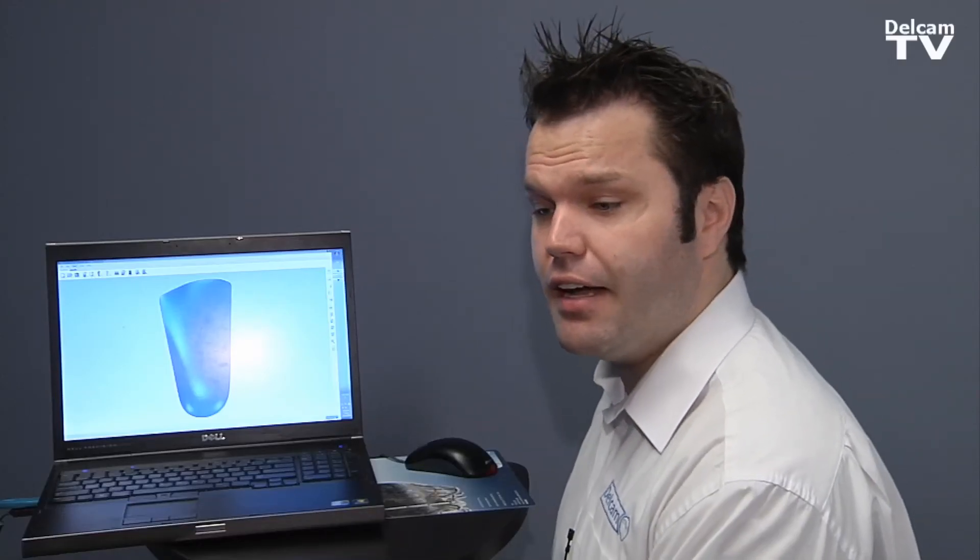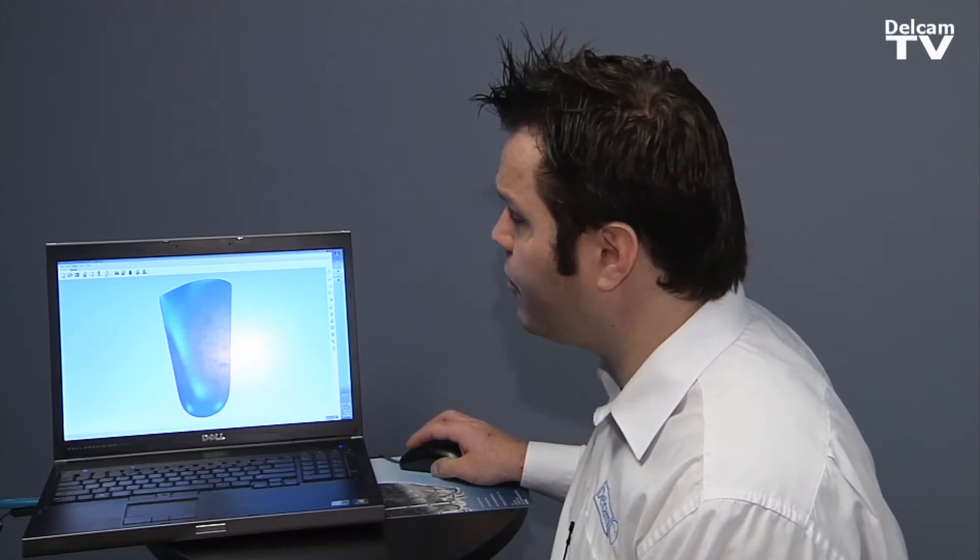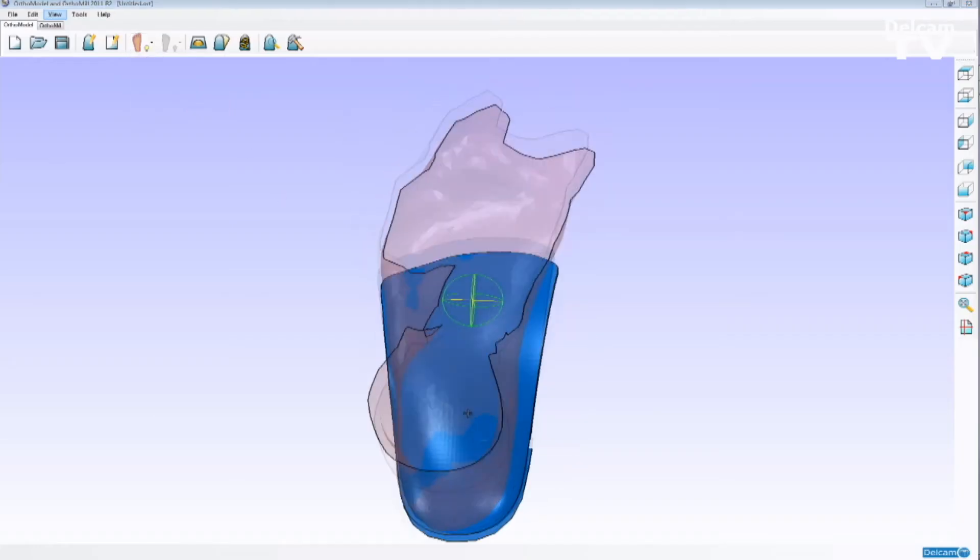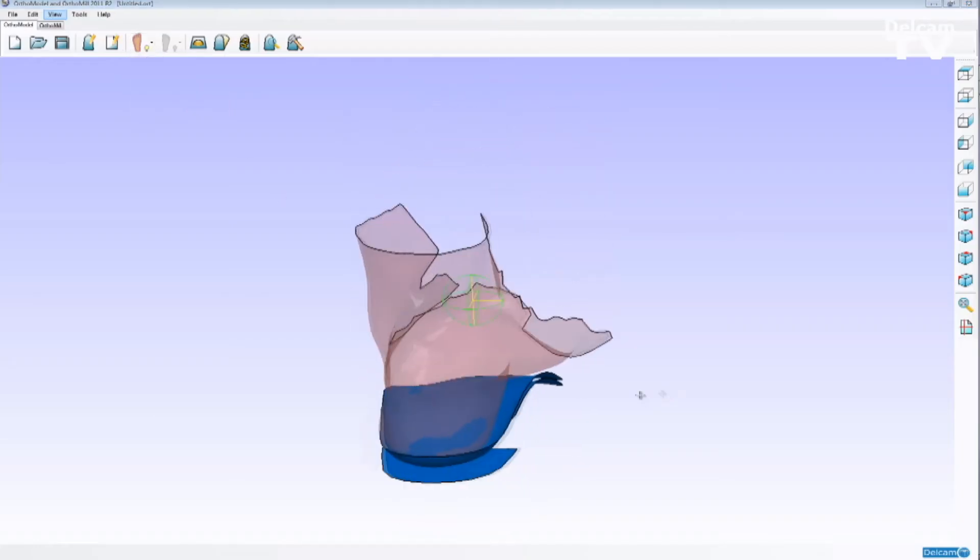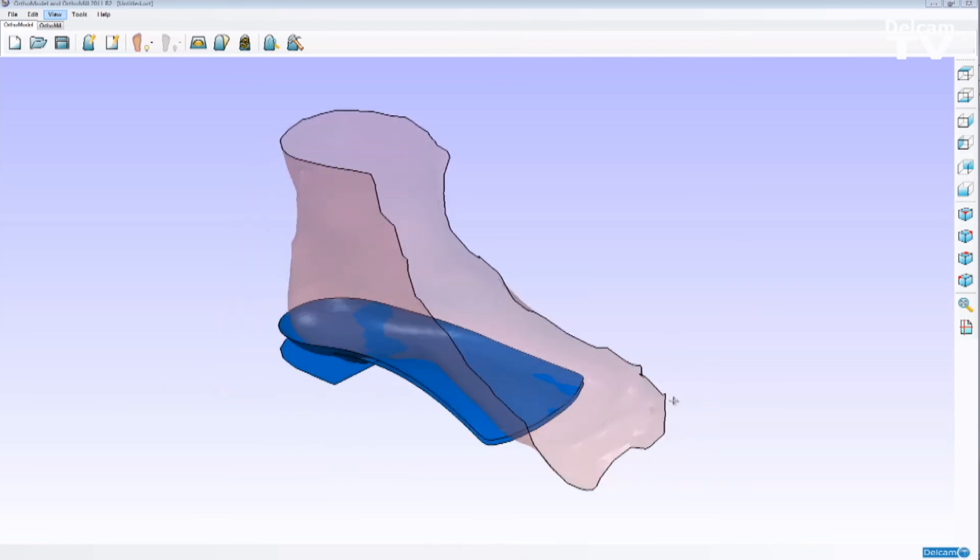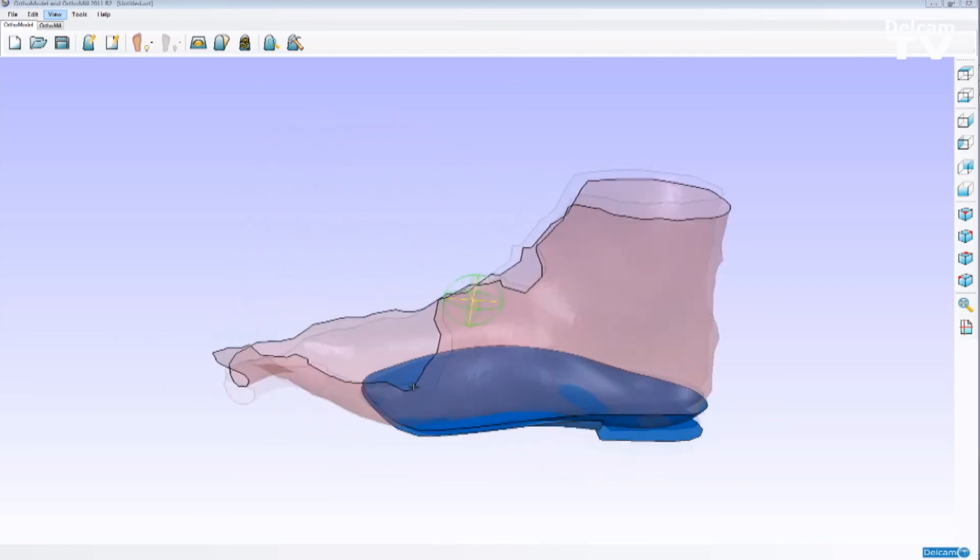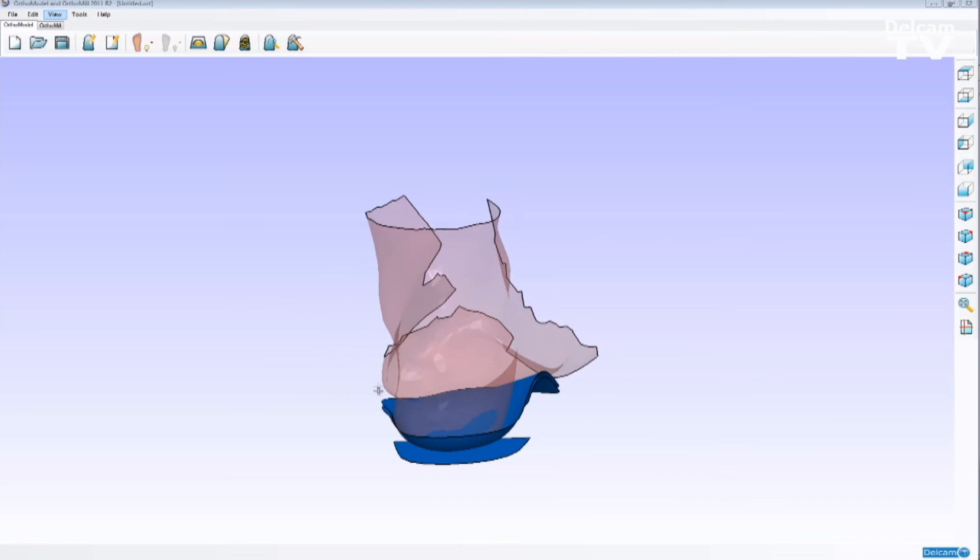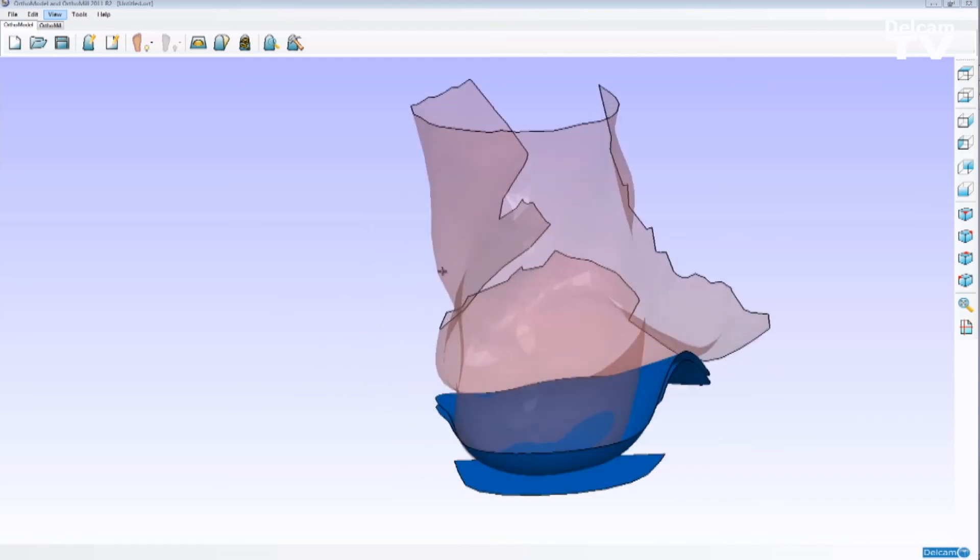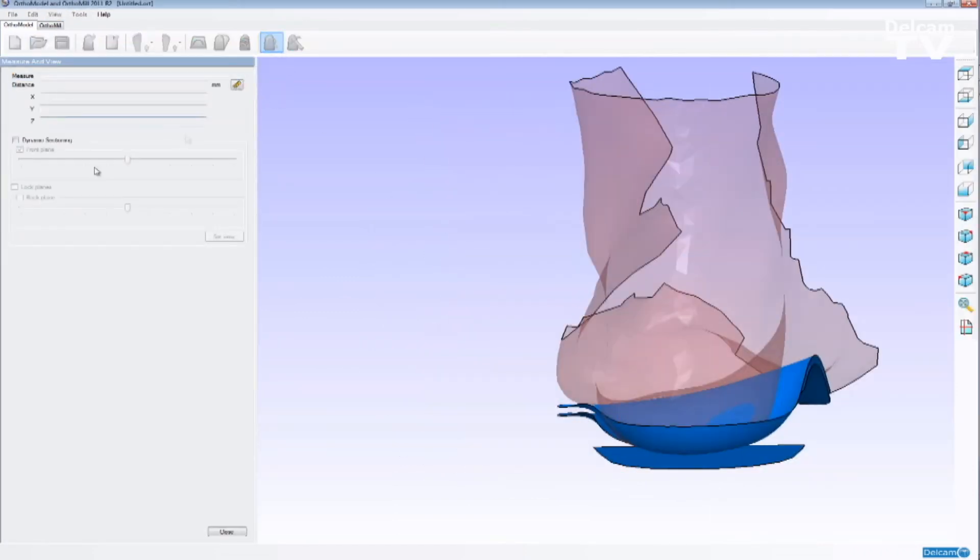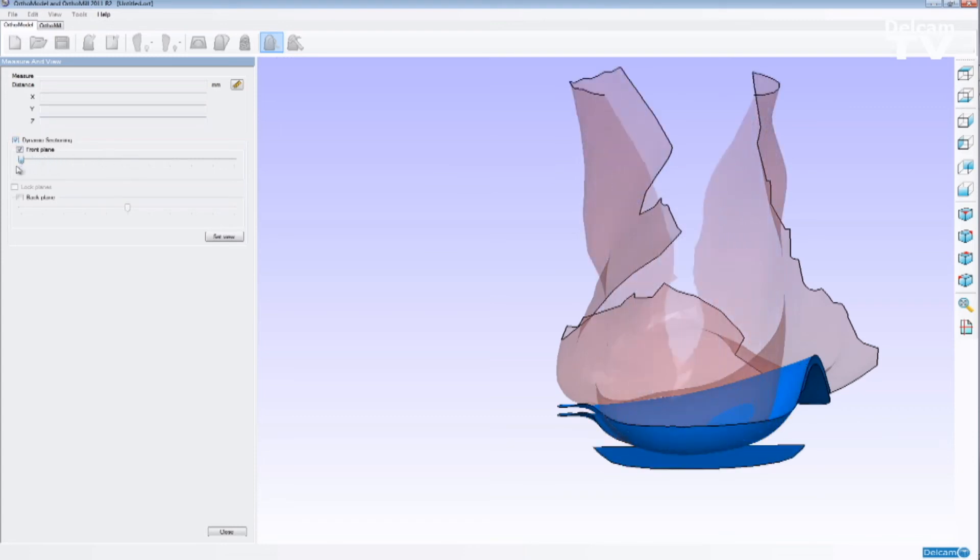Now that the orthotic has been designed, an extremely useful feature that we have in the software is the ability to show the foot scan overlaying on top of the orthotic. And we can see exactly how OrthoModel has designed the orthotic. But also, the user is able to dissect the foot and the orthotic by selecting this option and check how the orthotic is touching the patient's foot, as you can see on the screen.